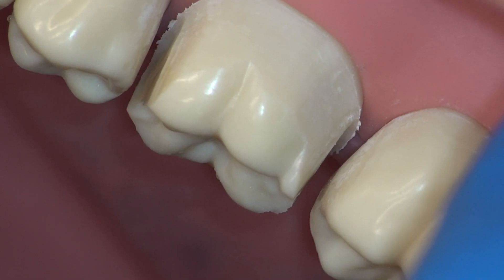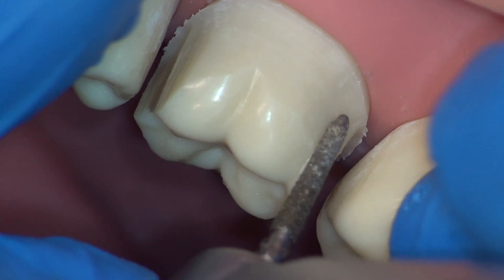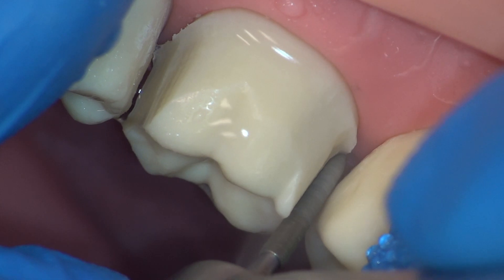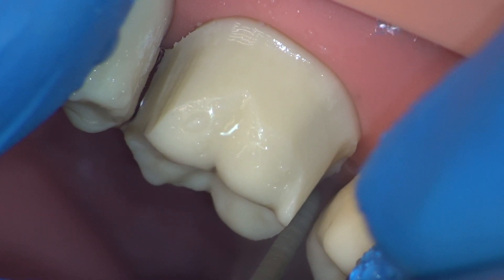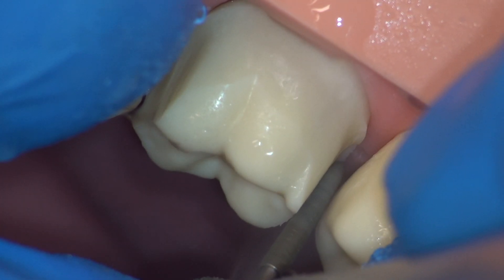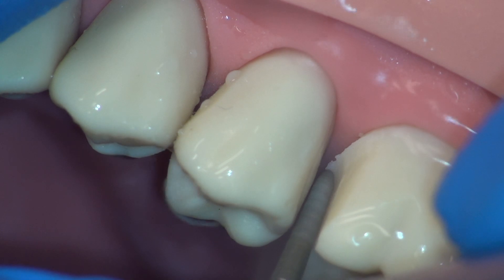Next, we will complete the interproximal separation using our final burr. Check the amount of clearance you have before moving through and proceed accordingly. This step should be completed very slowly and methodically, watching the tip of the burr and watching the side of the burr closest to the adjacent tooth. Keep in mind that the more apically the burr is positioned, the more clearance you will have as the tooth is narrowest at the neck. Moving on to the mesial aspect, the separation is completed in the same manner.